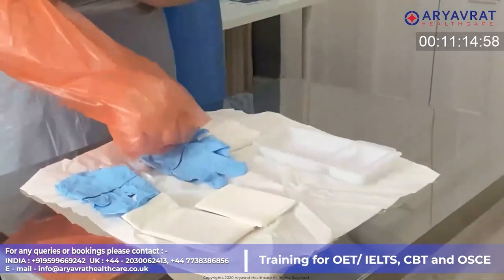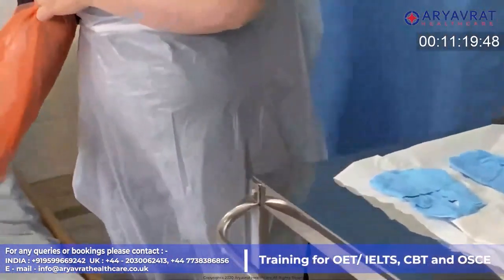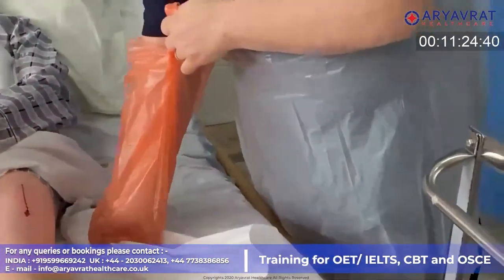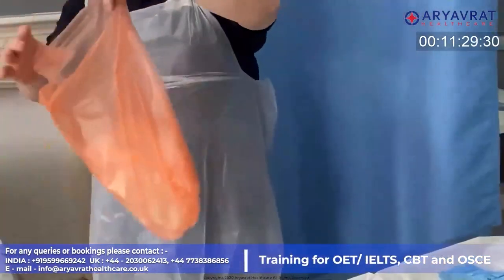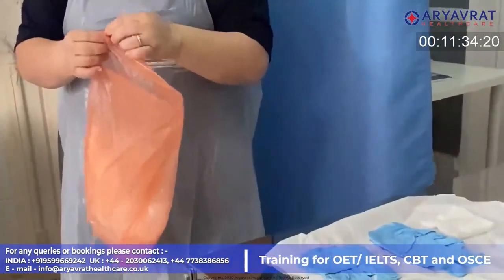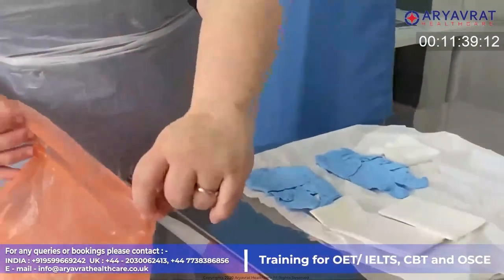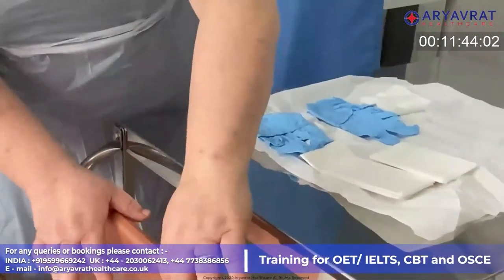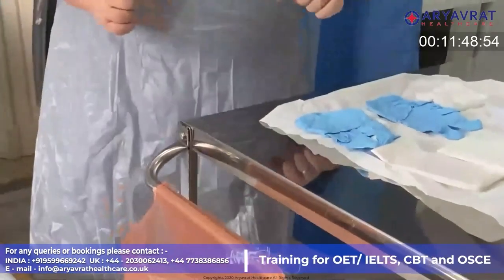And trying to touch things as least as possible. I'm now going to take away this drape here, okay, Raj? Might feel a bit strange coming from the leg there. And I'm reversing the bag. And I am going to use the sticky tape to secure the bag here, which I will now use as my rubbish bag. And I need to make sure that that is in between the patient and my sterile field.